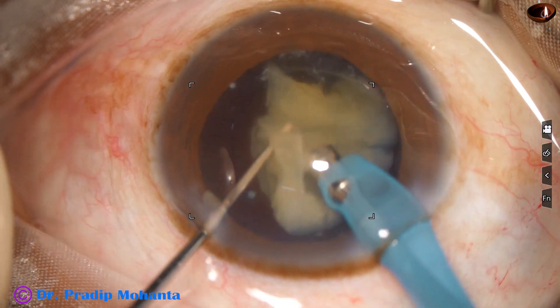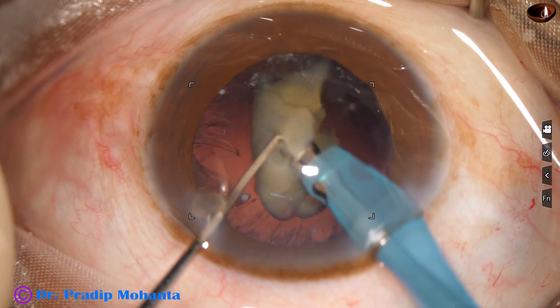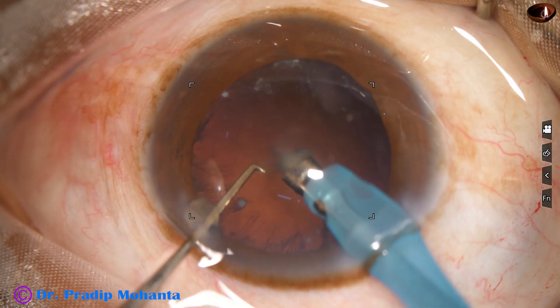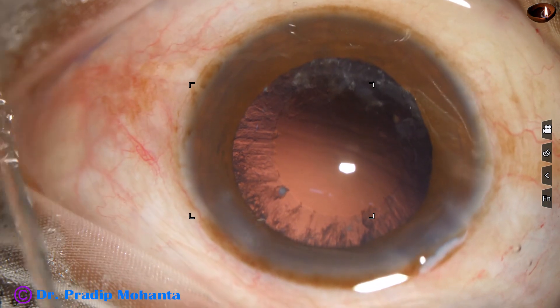Bevel down may be dangerous — you may engage the posterior capsule if there is no nuclear mass in front. So bevel sideways is a little safer. Done. The nucleus has been managed.